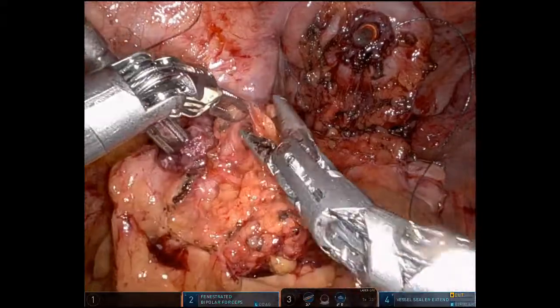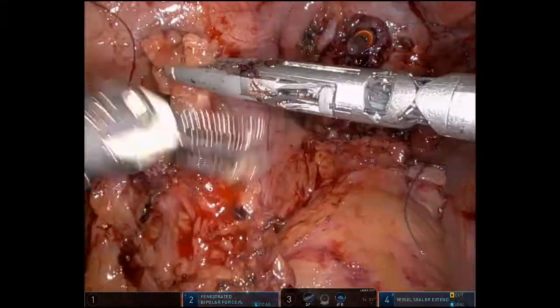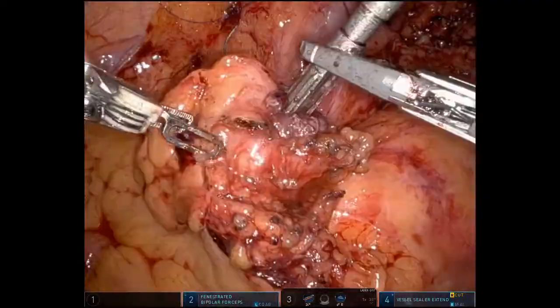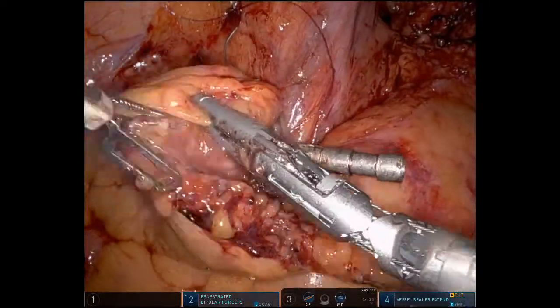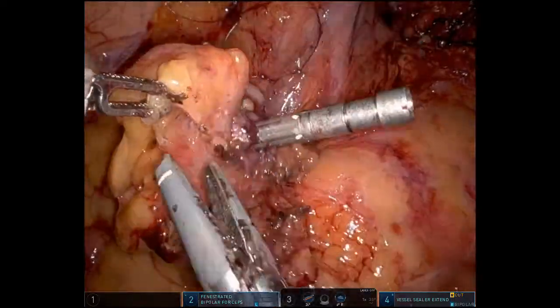It looked okay, but as we're taking down the fat and really dissecting, we see a small diverticulum right there on the edge. And as we go to the other side, we see a much larger diverticulum. You really never know — is there just fat there, or is there a diverticulum that's going to be right in the anastomosis, which would portend a higher failure rate?